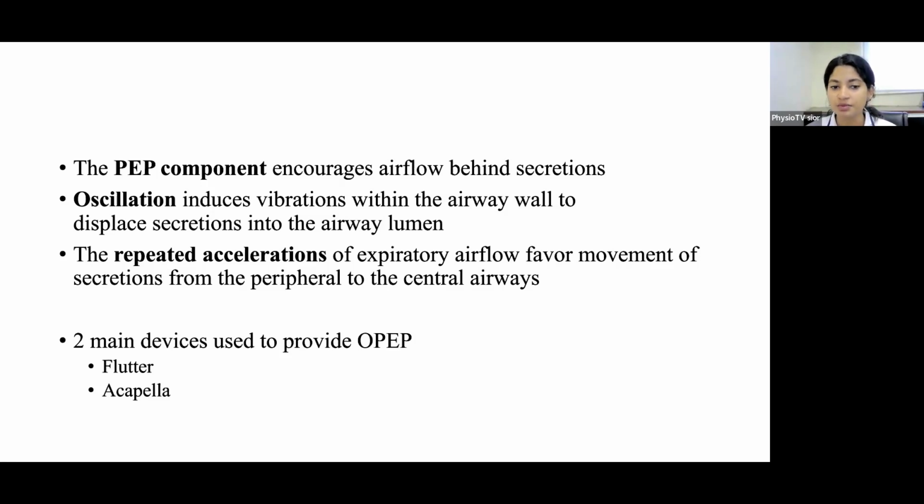Okay, and these repeated accelerations will also help in moving the secretions from the periphery to the proximal airways, into the larger airways.